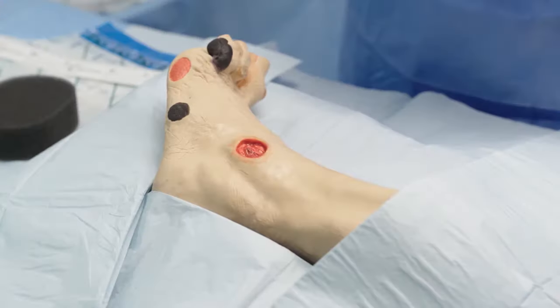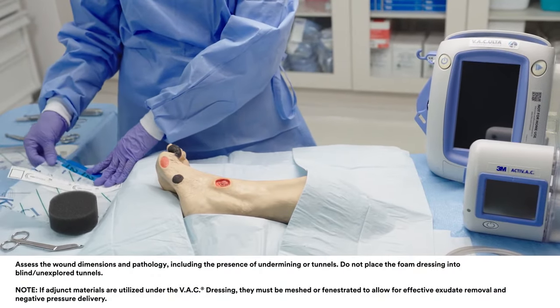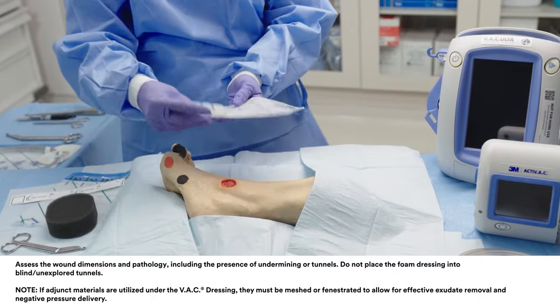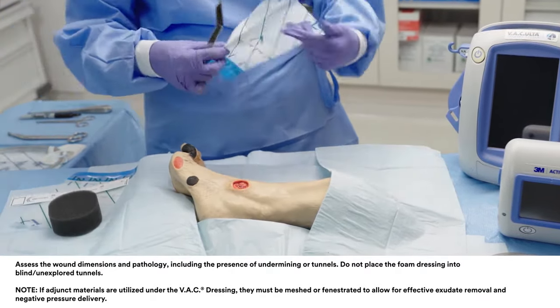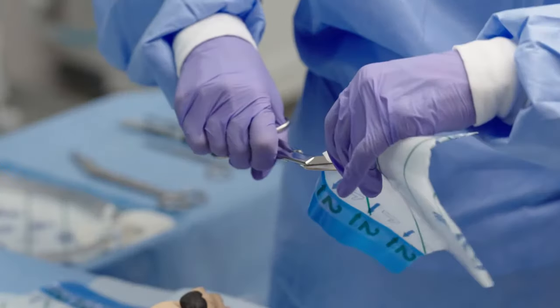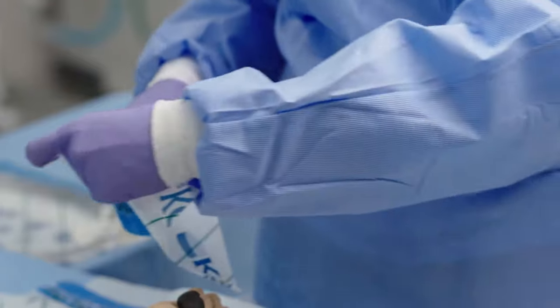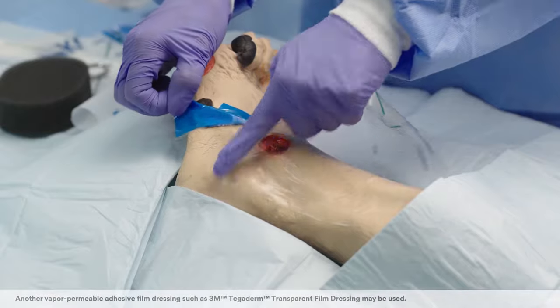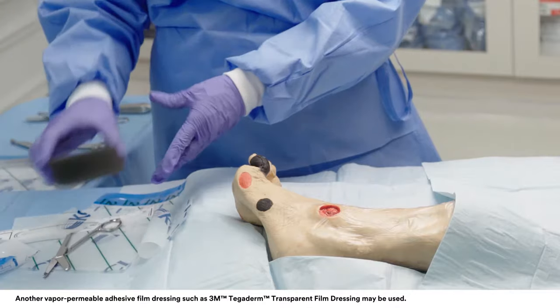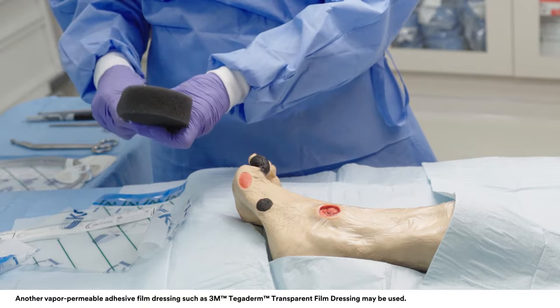Shown here is a foot wound requiring a standard VAC dressing. Prepare the peri-wound area and picture frame or windowpane the wound with a hydrocolloid dressing or another vapor-permeable adhesive film dressing such as VAC Drape or 3M Tegaderm transparent film dressing. To protect intact skin from direct contact with the foam, cut a piece of VAC Drape to accommodate the entire length from the wound site to where the Sensatrac Pad will be placed.